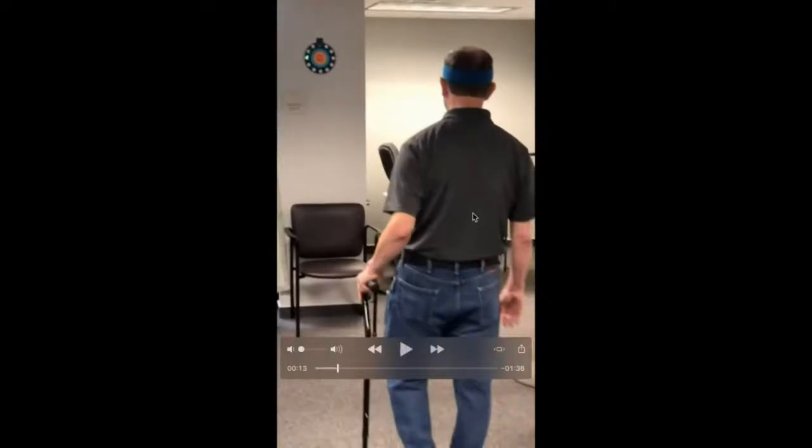And as everybody's probably understanding on this call, that forward posture, that center of gravity change can be super important as far as predictability for falls. Mix that with a bradykinetic and a freezing posture, and that's where Parkinsonian patients really get into trouble. So he is using this for training of upright posture, gaze fixation out into the community rather than typical gaze fixation, which is down here at the floor, and working on that through different functional patterns.